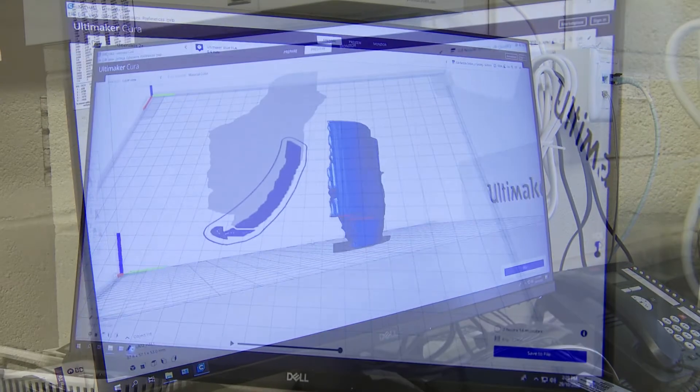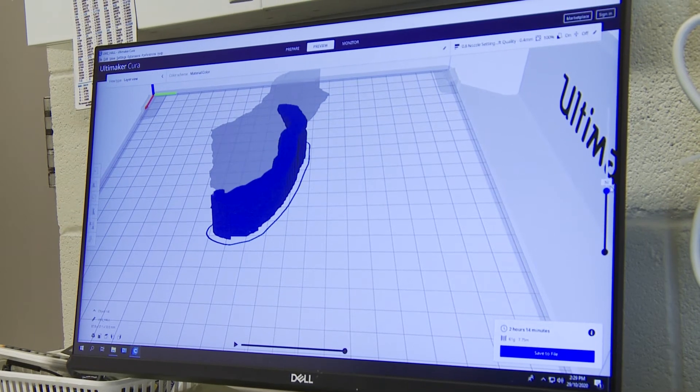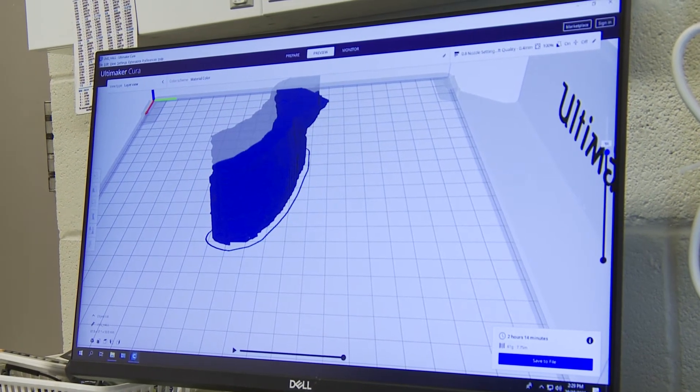As the job progresses, it'll keep building up layer by layer, and the projected time to complete this is 2 hours and 14 minutes.